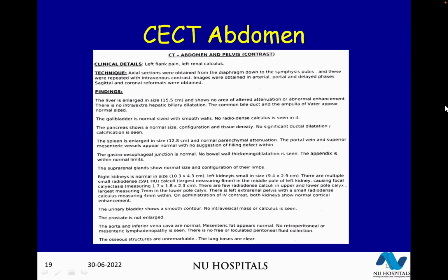So when you already know that the kidney is obstructed from the CT scan, you got a dilated pelvis, we have discussed that this ureter is hopelessly scarred and you're not looking for obstruction. So when there is clear-cut evidence of obstruction, there is no point in doing that DTPA unless you have doubtful obstruction, in which case you might do some other test. So you want to look at cortical function and therefore a DMSA may be useful in this situation. It's not for looking at a scar because the CT scan is already showing you many things.